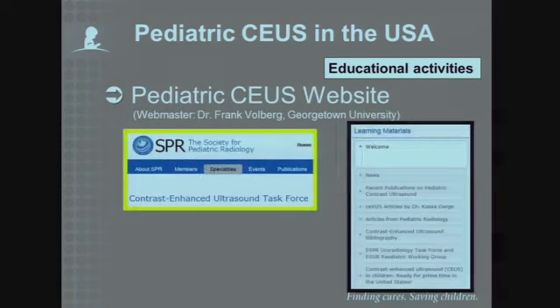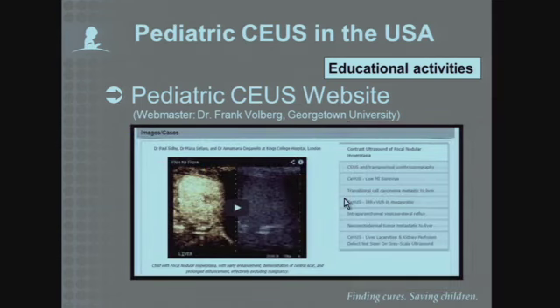So the SPR task force has developed a website that is available to SPR members where you can go and get all kinds of information about pediatric contrast ultrasound, including all of the current publications on this topic in children. We have various cases available for review on this website, various different pathologies.